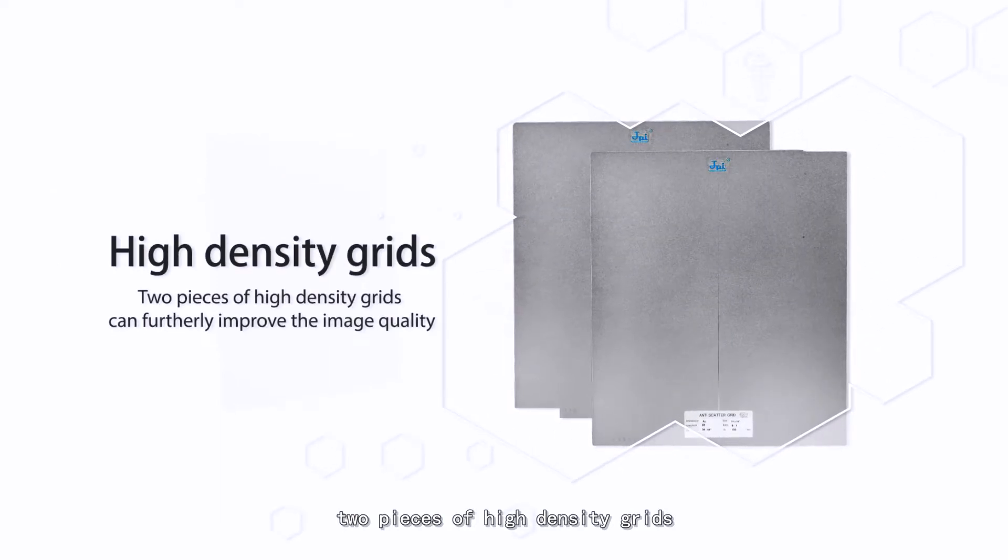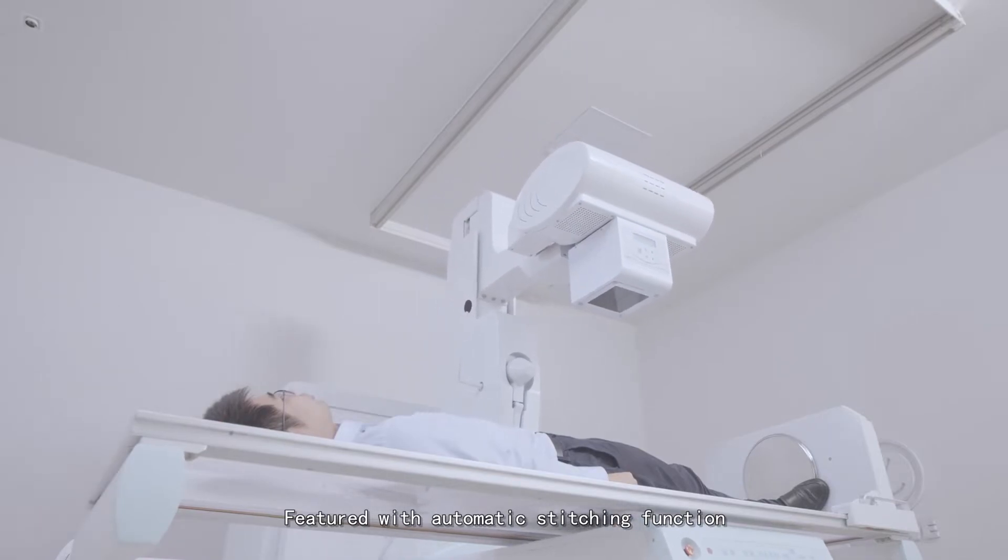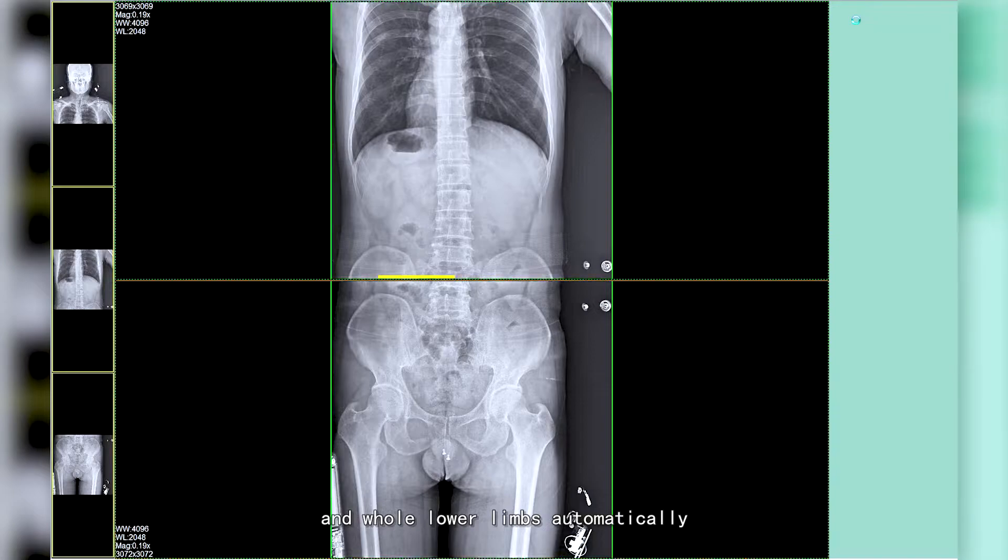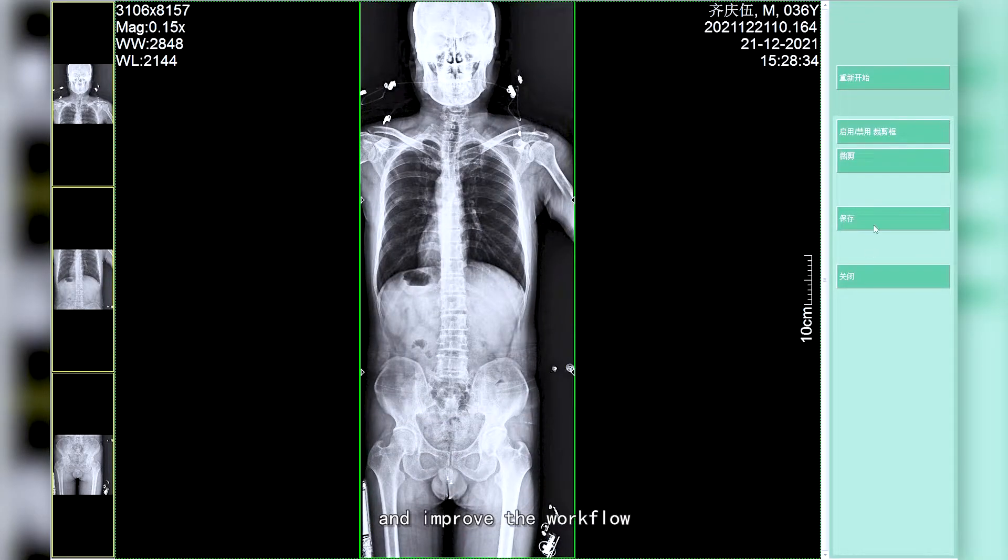Besides that, two pieces of high-density grids can further improve the image quality. Featured with automatic stitching function, it can produce an intact image for whole spine and whole lower limbs automatically, making doctors' work easier and improving the workflow.